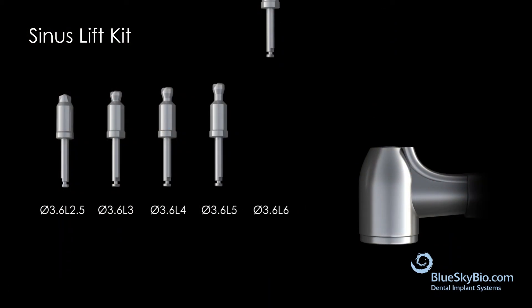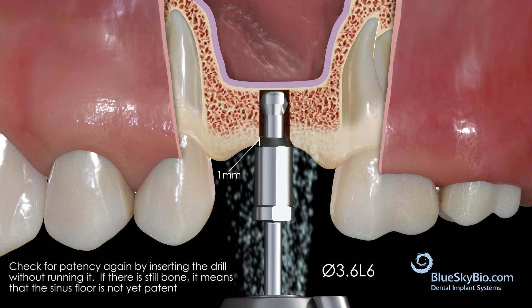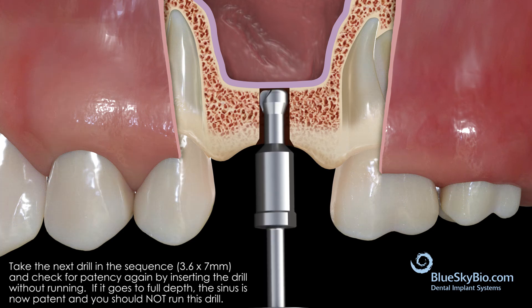Repeat the process with the 6 millimeter long drill, taking it to depth without running it. If there is still bone, proceed with drilling. Now take the 7 millimeter long drill to full depth without running it. If it goes to full depth, the sinus is now patent and you should not run this drill.